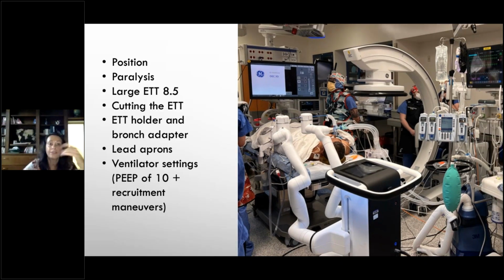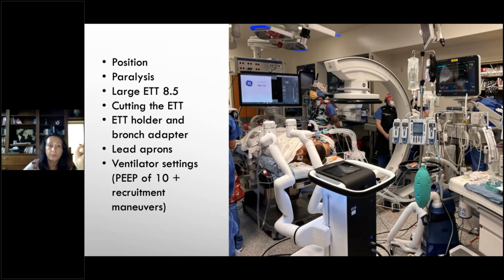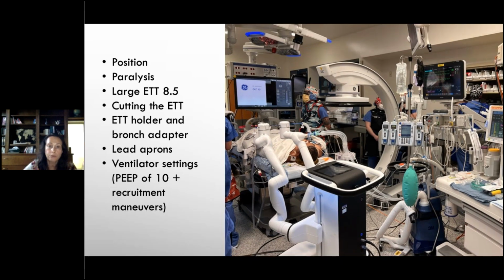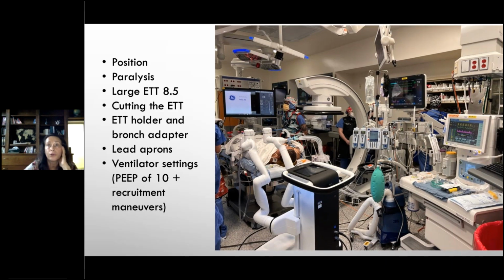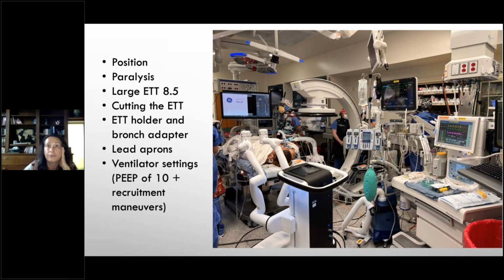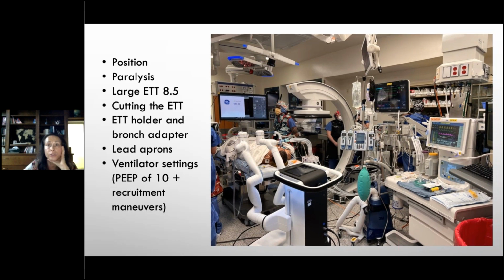The main thing is the ventilator settings. The recommendation is to use 10 of PEEP and to use the recruitment maneuver. This recommendation is based on the VESPA study, the ventilatory strategy to prevent atelectasis during bronchoscopy under general anesthesia. The study was done at MD Anderson Cancer Center in Texas.